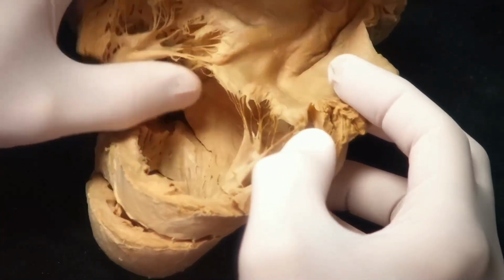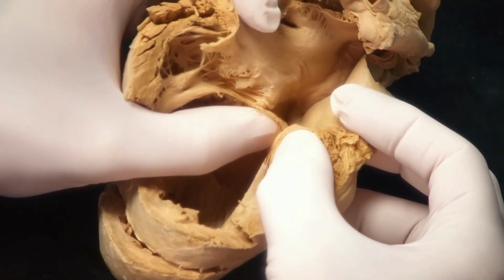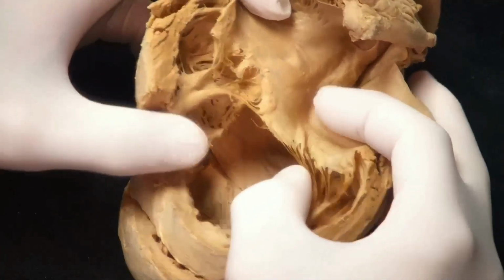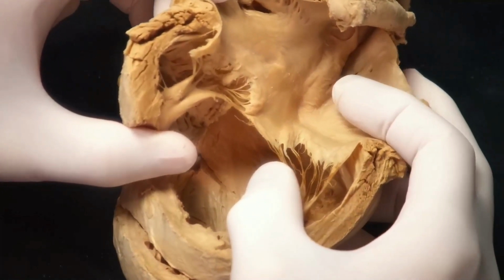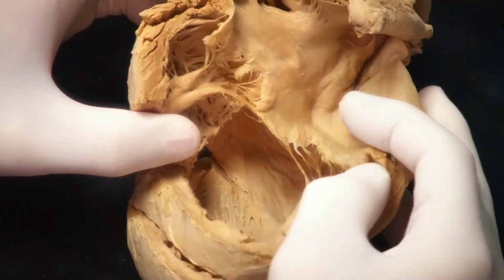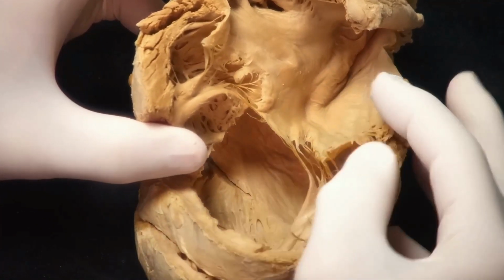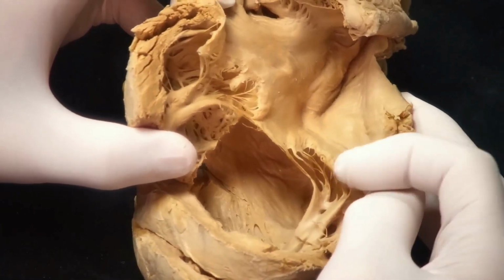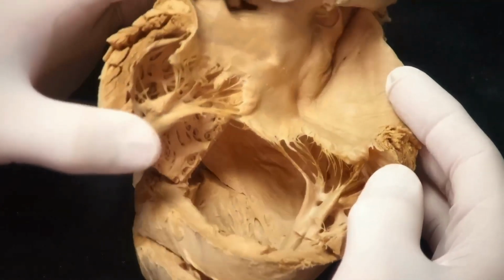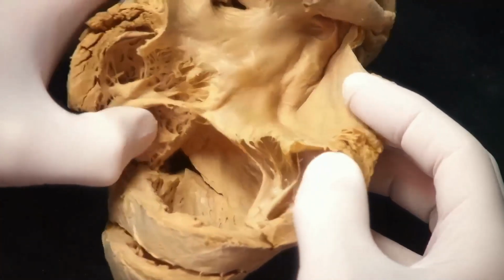The anterior leaflet will then try to meet that in order to coapt together. So the leaflets try to coapt, and therefore there's more tension potentially on the anterior leaflet, which is more stretched. And that, of course, if you're clipping these leaflets, can lead to additional stress on the leaflet. So obviously you've got to be careful not to tear the leaflet, and you might want to consider which type of clip you use to perform edge-to-edge repair in this situation.